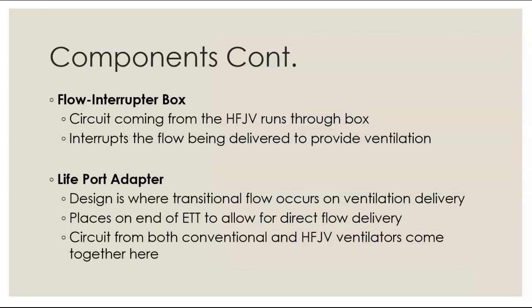Okay, other components with the jet ventilator. We have the flow interrupter box, which is, we're giving that continuous flow, and then we're interrupting to provide the high frequency breath delivery.